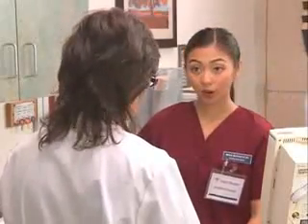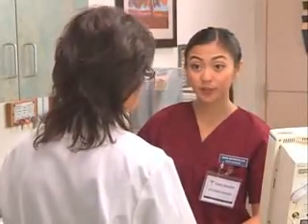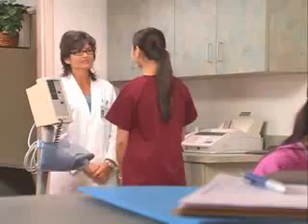What can you tell me about measuring blood pressure this way? This unit determines blood pressure by analyzing the sounds of blood flow, and it does it automatically. And is there anything to watch out for? A few things. Irregular heart rates, excessive patient movement, and environmental noise could interfere with the readings. Good. You know what to watch out for. Any questions, concerns? No, I'm ready. Okay then, lead the way.